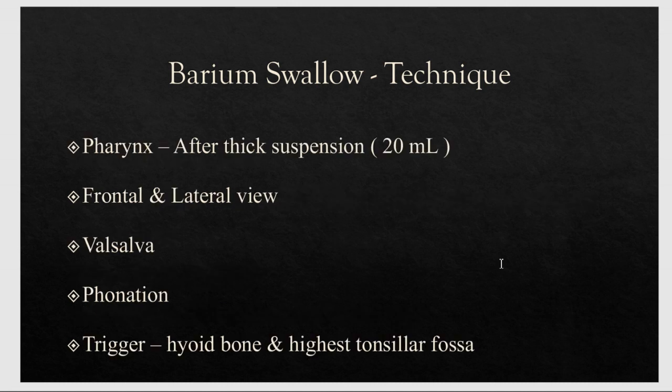Another important thing, if we want to just visualize the pharynx, the posteriormost part of the oral cavity, after giving the patient around 20 ml of thick suspension, this can be visualized, and sometimes we can ask the patient to do the Valsalva maneuver. You must be knowing it.